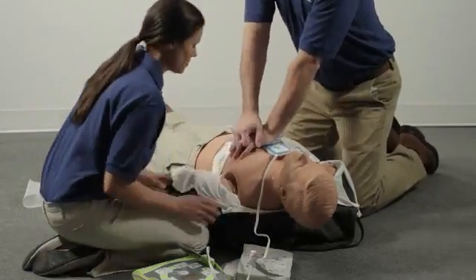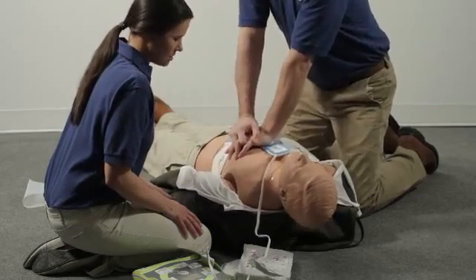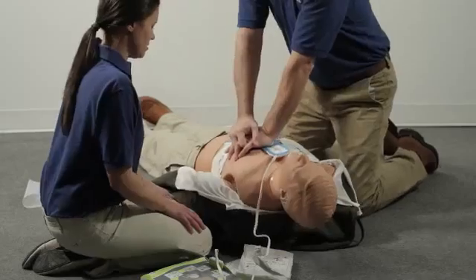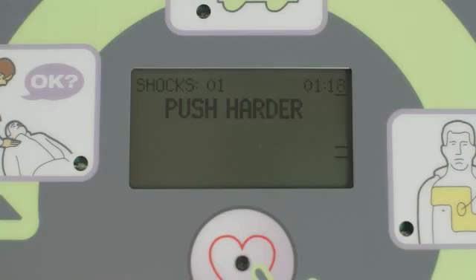Begin CPR for 2 minutes of pumping the chest 30 times and giving 2 breaths. If your compressions fall short of 2 inches, the AED will say push harder and let you know every 15 seconds until you reach the target depth. When your compressions become deeper than 2 inches, the AED will again let you know. Push harder. Good compression.